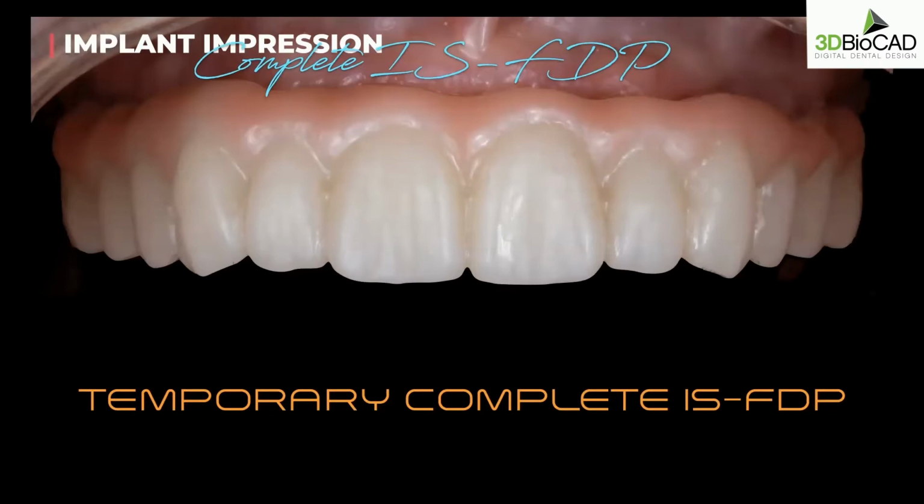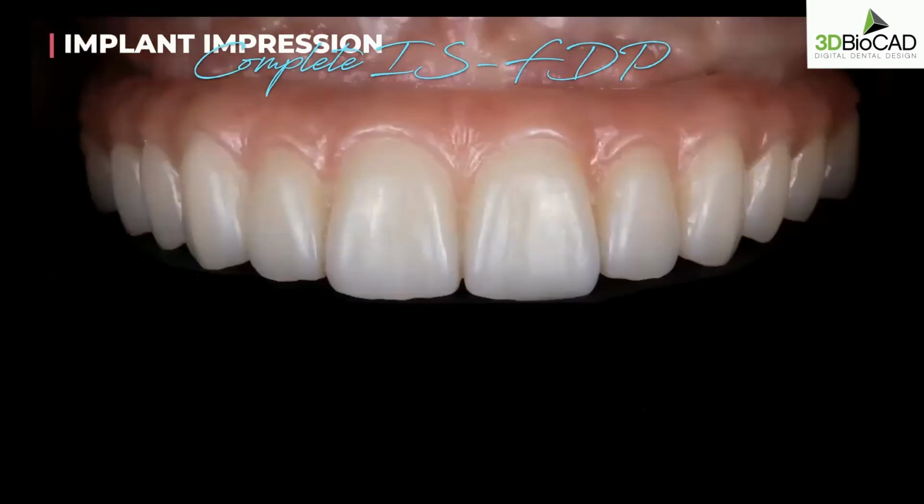And if anything has to be adjusted, we make the adjustments to the temporary, and we'll send that back to the lab, and then the lab will make us the final restoration.